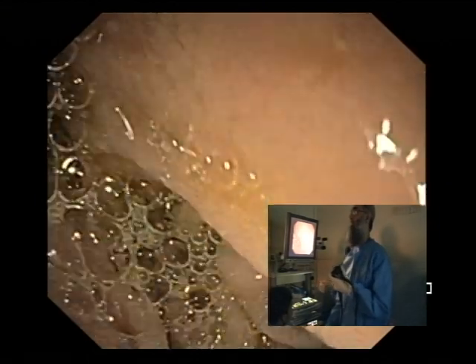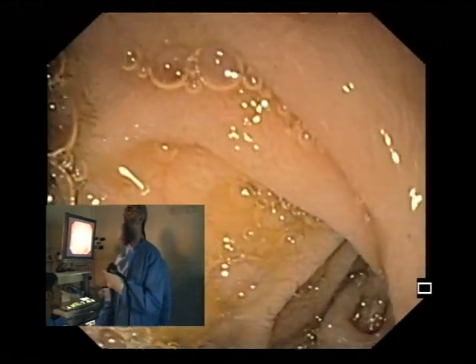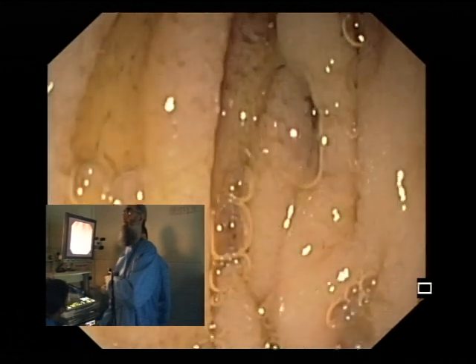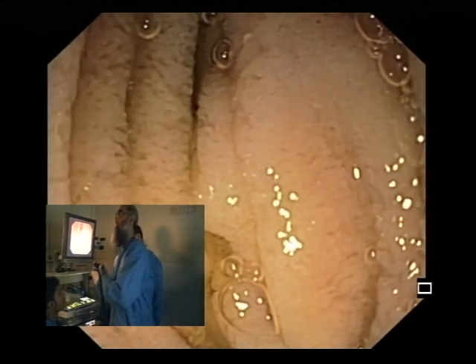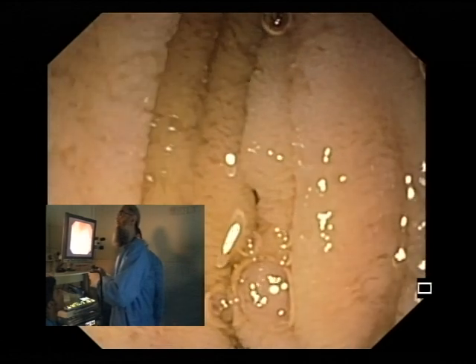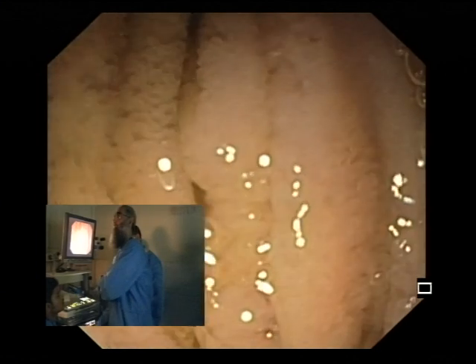So it will be like ERCP, you have to go through the second portion. Elevator will be a big wheel towards you. Or rather than pushing more, once you're around the turn, you may actually want to start reducing. Small wheel to your right. And then maybe like you do in endoscopy and ERCP, thumb down, so big wheel towards you, or gently reduce the scope to pull towards you.